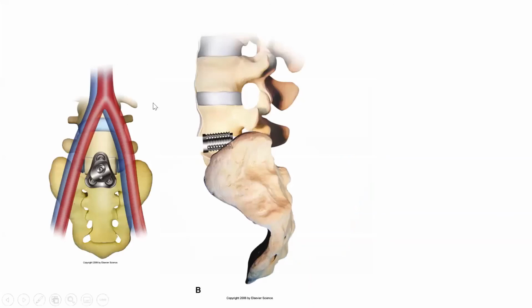There's some fusion devices on your anterior approach. So it depends where you're trying to get to. L5 and S1 sits in the crotch of the bifurcation, so you don't have to mobilize the vessels too much. If you're trying to get the L4-5 disc, usually the crotch sits about here, so you've got to move the vessels out the way.